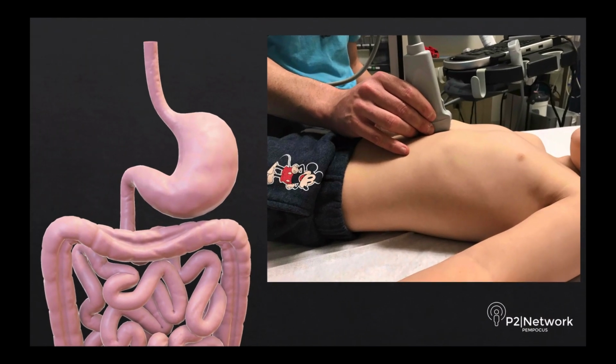Here we once again have our patient lying in the supine position with the probe in the sagittal subxiphoid location, which should be located along the gastric antrum. From here, if we rotate our probe in a counterclockwise fashion and slide it up towards the gastric body and fundus, we can hopefully assess the full length of the stomach, and then you can repeat that evaluation in more of a long axis as well.